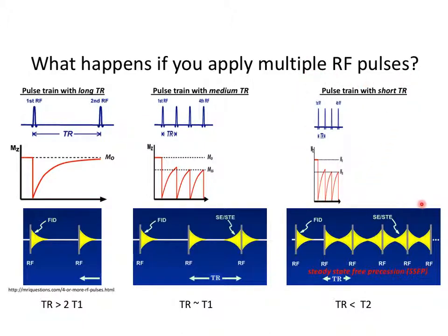So usually the thing that limits this type of acquisition, the SSFP acquisition, oftentimes is the amount of RF that you can essentially transmit into the patient, right? Because if we have relatively high tip angles and they're only a few milliseconds apart, that's a lot of RF going into the patient compared to this. And large people will heat up when you do this, right?